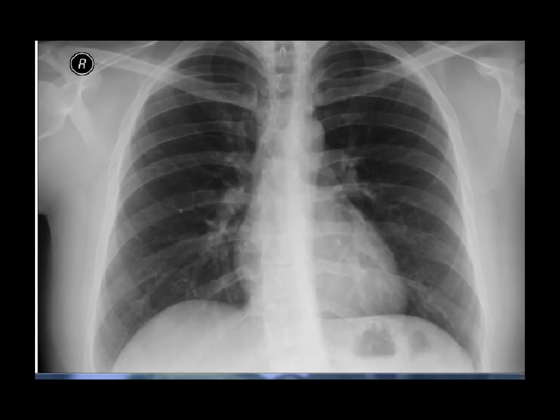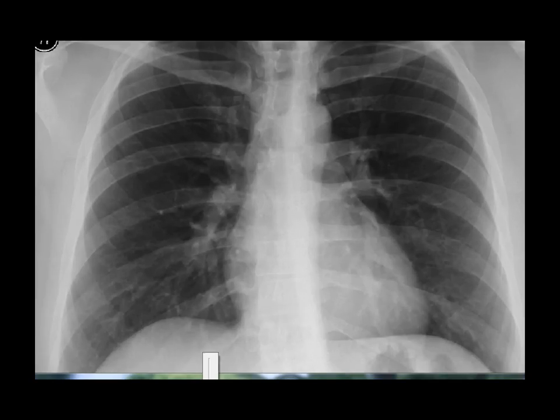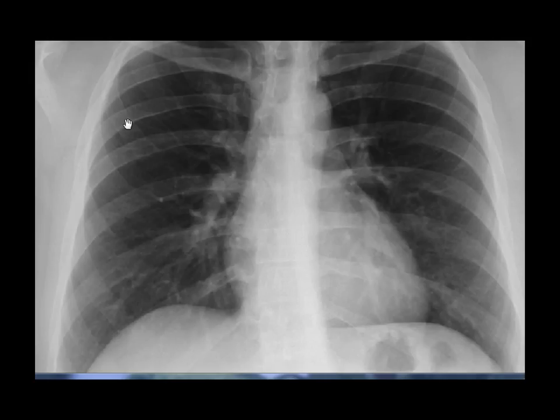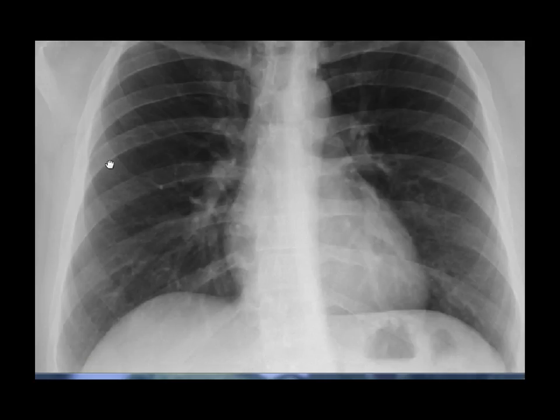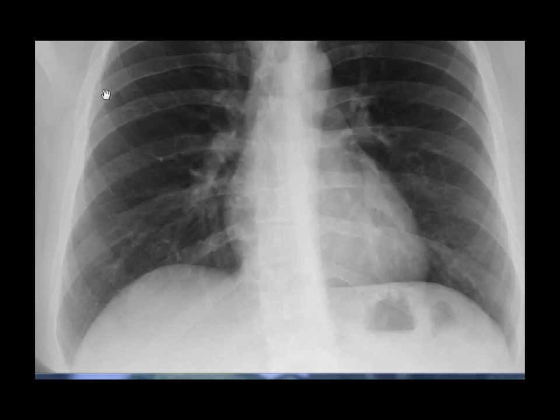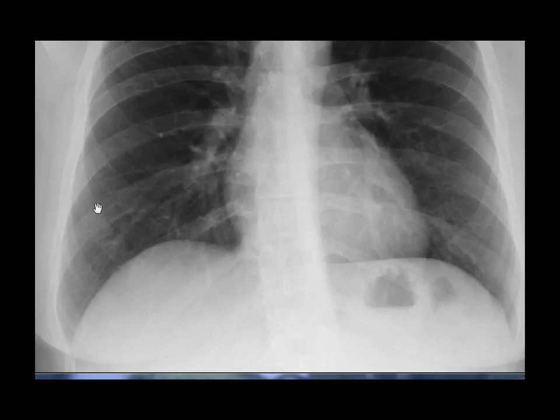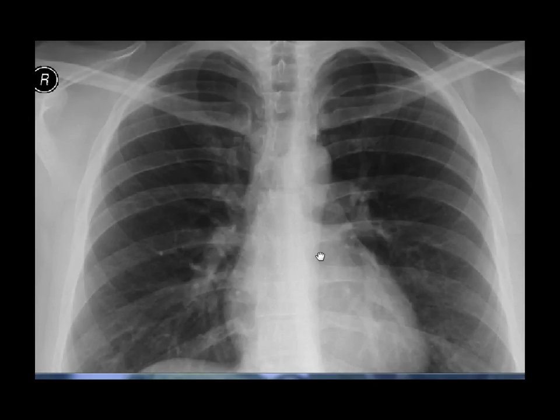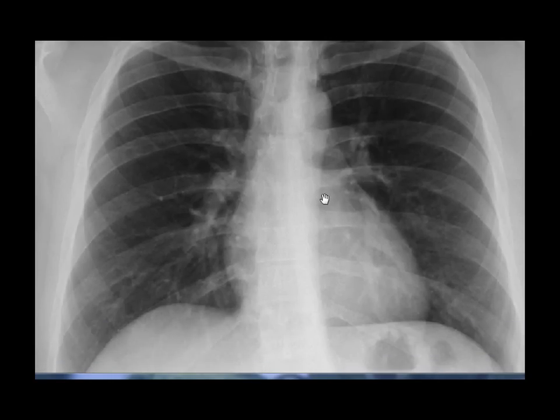On the lateral chest wall in a normal X-ray, there are no horizontal opacities, and in fact there are no vascular markings visible in the peripheral zones. Thank you very much.